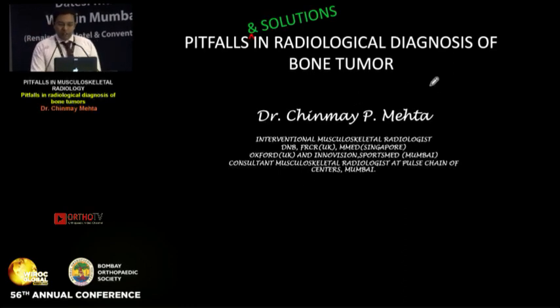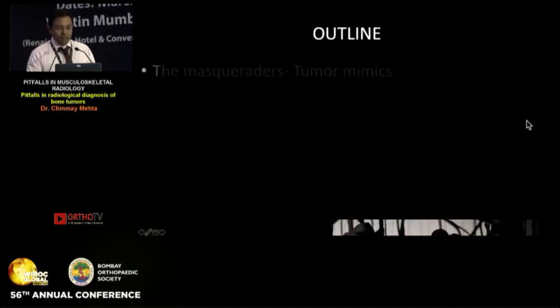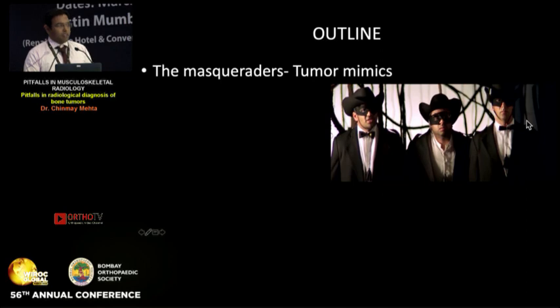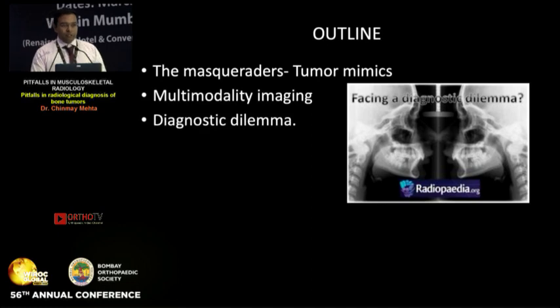Pitfalls in radiological diagnosis of bone tumors sounded a tricky topic, and as Dr. Daftari says, tell me the solutions and not the problem. So we'll have a mix of pitfalls as well as its solutions to the best of my knowledge. The outline is first we'll look at the masqueraders, the tumor mimics, then we'll see the role of multimodality imaging, and finally the diagnostic dilemma.